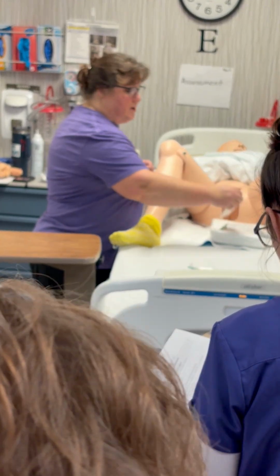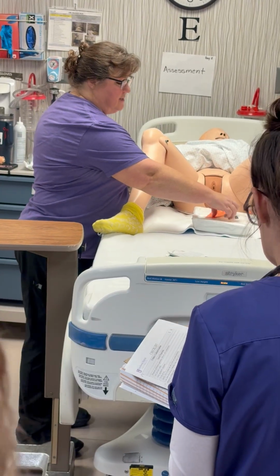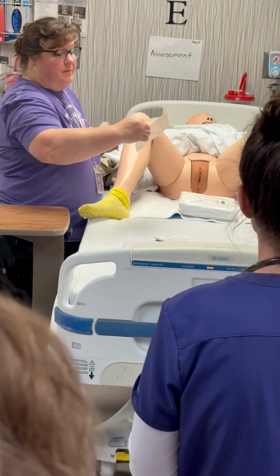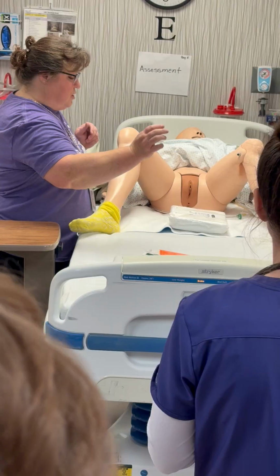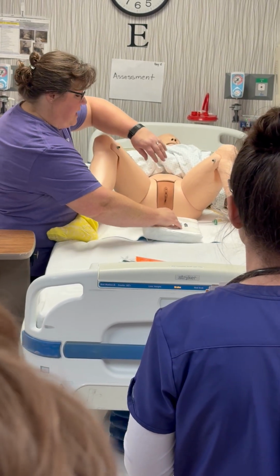These are all of our instructions. We already know how to do that. That goes in the trash. This, a lot of times they put on the outside of the Foley bag for your information if you want to put it on there. Not everybody puts this on there. That's trash. And then I'm going to open up my tray.